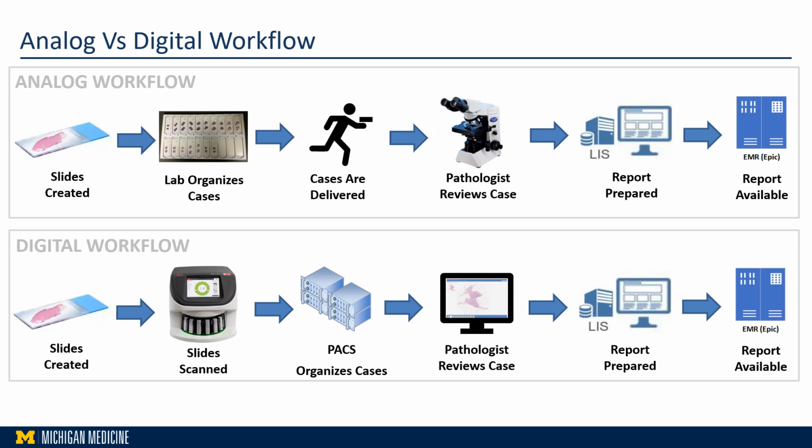The lab information system will push the report to the electronic medical record for patient review or patient receiving their path report, as well as to the clinical provider.